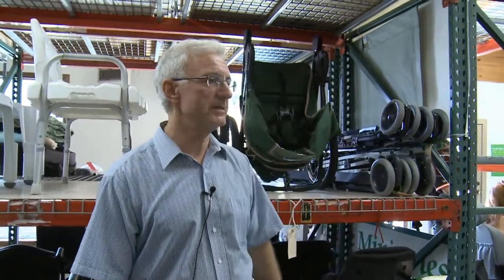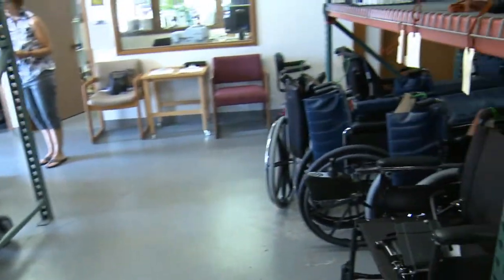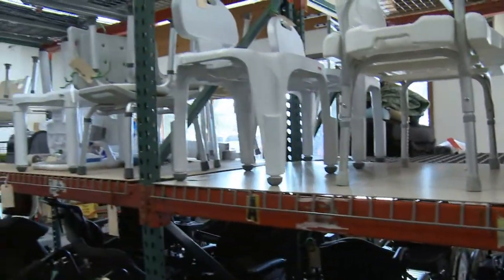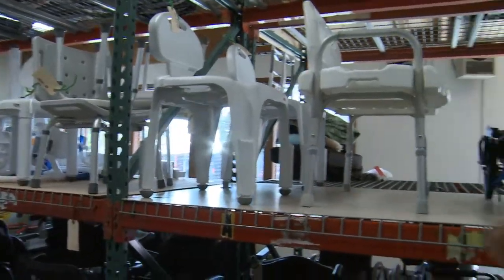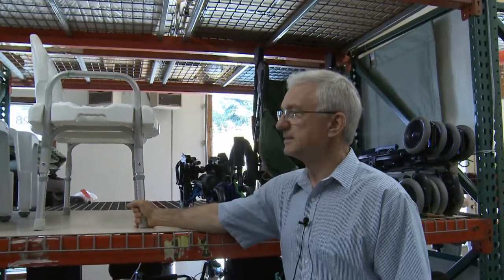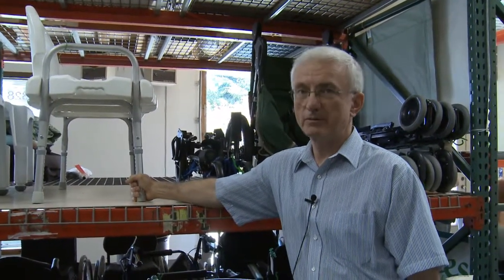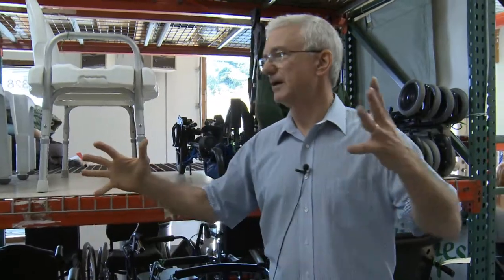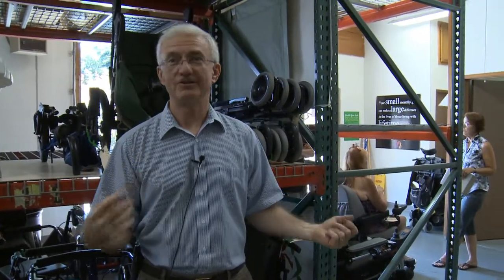We just try to make use of as much space as we can, and the inventory fluctuates up and down. Sometimes I don't have any shower chairs; right now I must have at least a dozen. I'm usually out of transfer benches, though I have one right now — those are very hard to come by. One reason is because Medicare and Medicaid don't pay for shower benches, transfer benches, commodes — the sorts of things connected with hygiene. They also don't cover transport wheelchairs. So those items are hard to come by because they're not covered by insurance and people tend to hold on to them, so you hope for those donations.